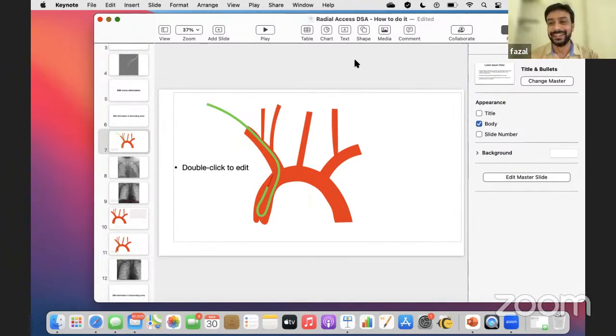But we've done a case of covered stent for a CC fistula, and for covered stents you need very good support. In this case, we took the covered stent all the way close to the petrous, and then we sent a Cat5 all the way into the ICA terminus, and then got the covered stent up. But we had some trouble doing it. I think the main problem was the wire selection. We were out of our supportive wires. We used Chikai Black for these cases. We tried to use a BMW, that wouldn't work, and then we used a Synchro because that was the only one available.